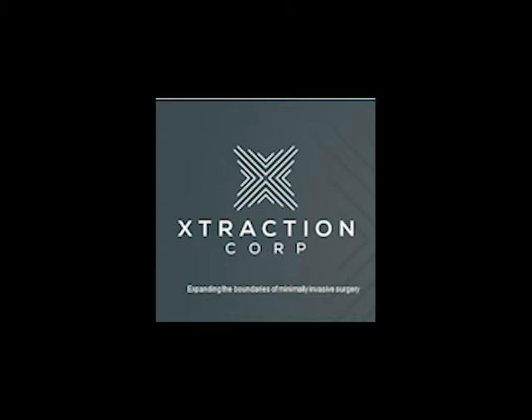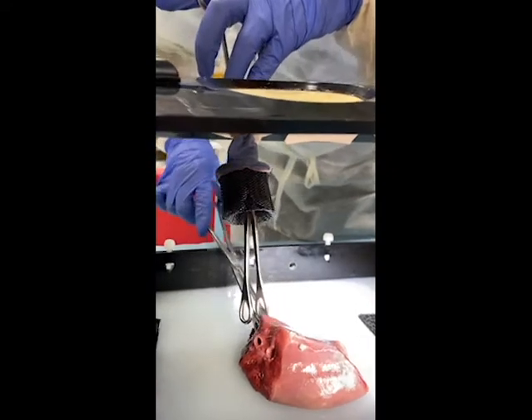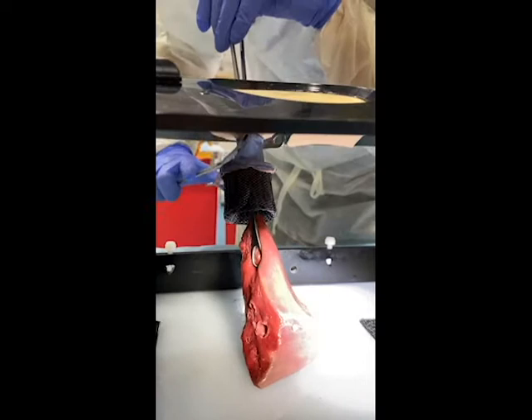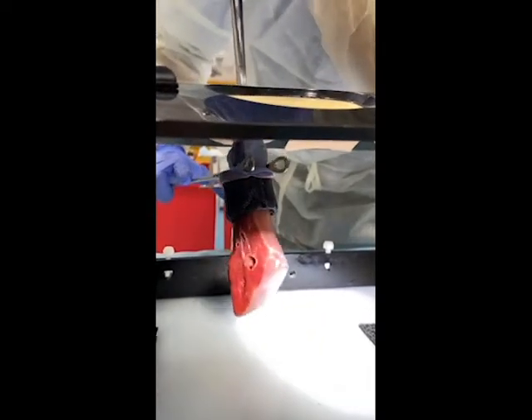Hi, this is Ian Makey with Extraction Corporation. I'm going to show you a couple of videos of our newest device, the sleeve, being used to extract several different specimens.